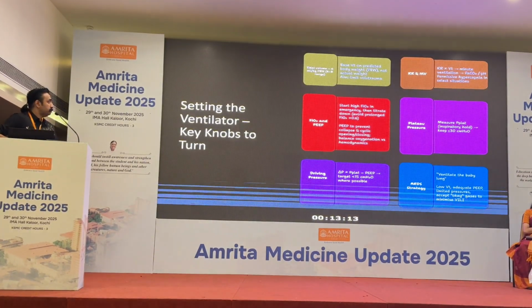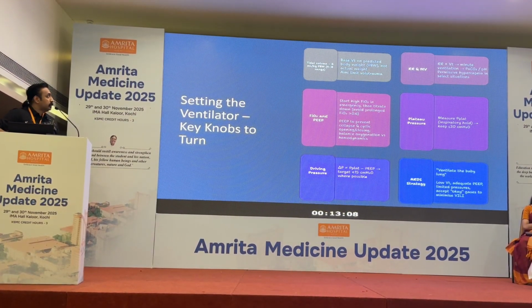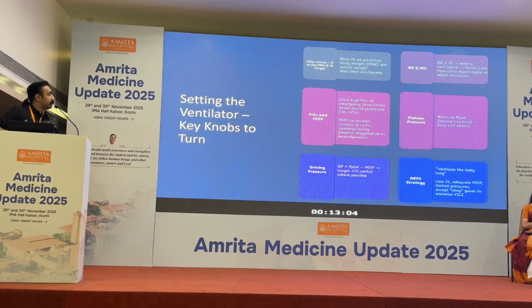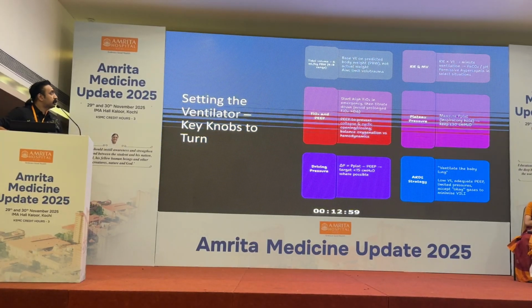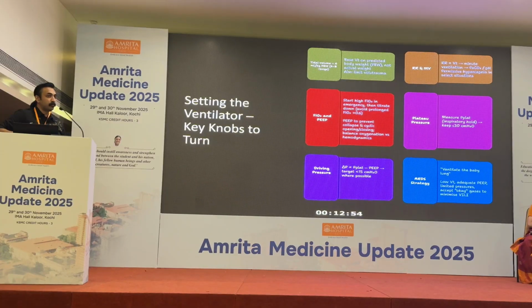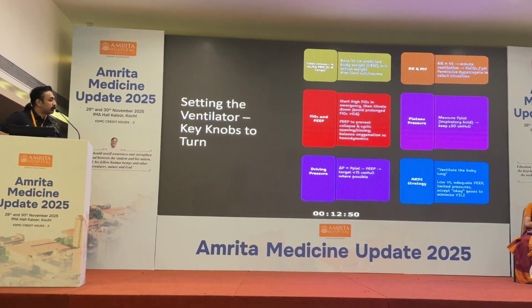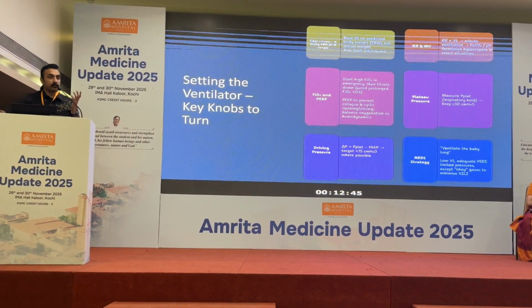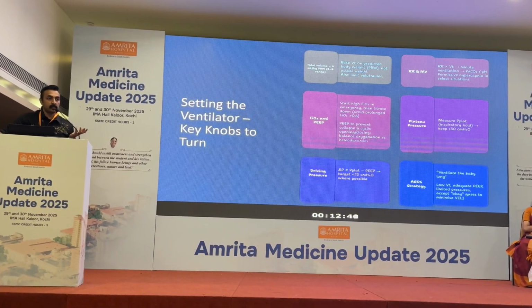Clear? Okay. Again, a cheat sheet kind of thing for initiation of ventilator. So once we start, most of the patients we start with 6 ml per kg of predicted body weight, right? So the range is usually between 4 to 8, and your base tidal volumes are based upon the predicted body weight. Respiratory rate, again, respiratory rate into tidal volume. So basically, what are you managing with your respiratory rate and tidal volume? Which factor is it, the hypoxia or the ventilation part?